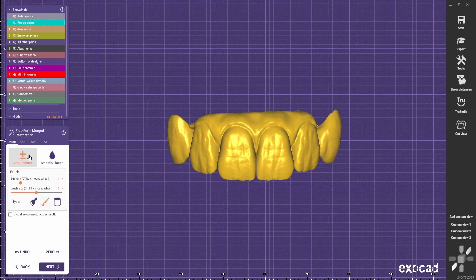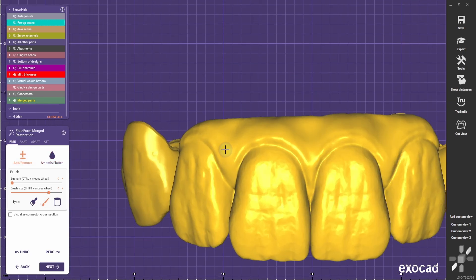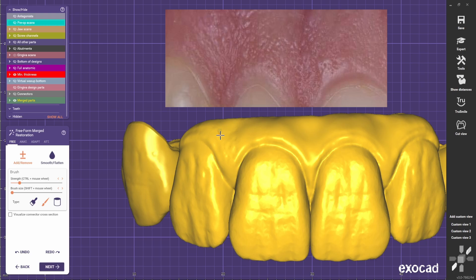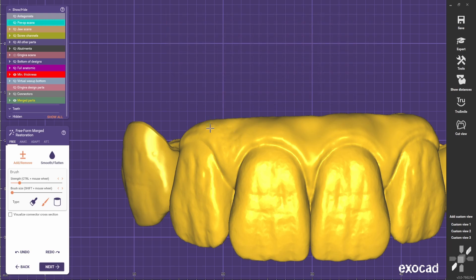So now we're going to take a look. One thing that we usually see in gingiva is that the gingiva is not smooth. It should have like some stippling. It's more like an orange peel. So I like to come with a small tool and just do some dots everywhere.